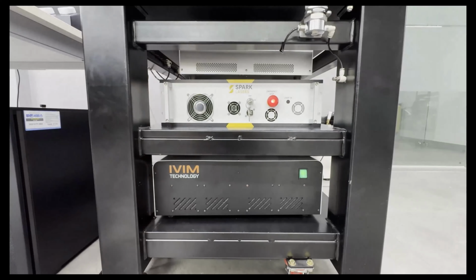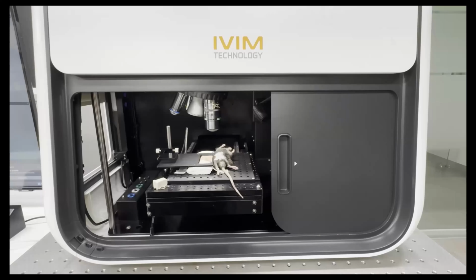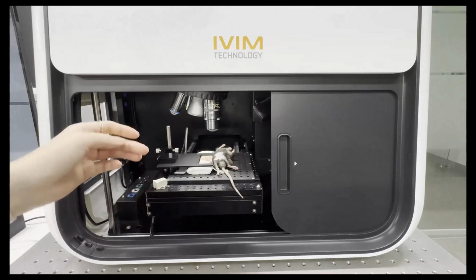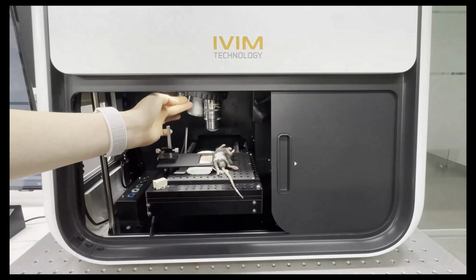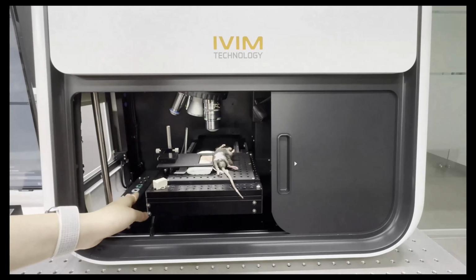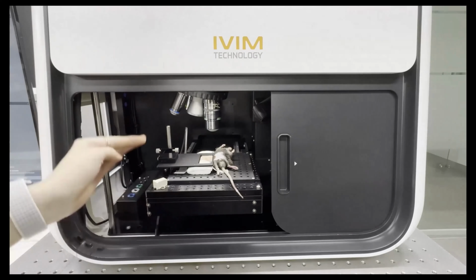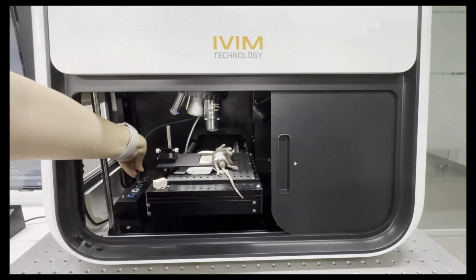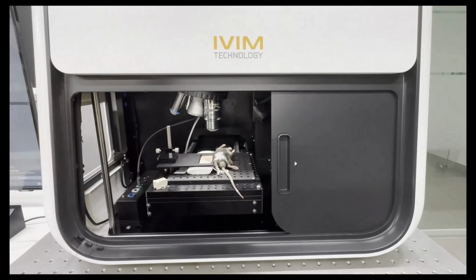If we go up to see the main body, there is a stage where the animal model is placed for imaging. And on the ceiling, there is a turret that can hold up to 5 optic lenses. Next to it, there are 5 ports where you can connect up to 5 temperature sensors. For example, if you want to keep the stage warm to maintain the mouse's body temperature, you just need to connect this cable to the port.